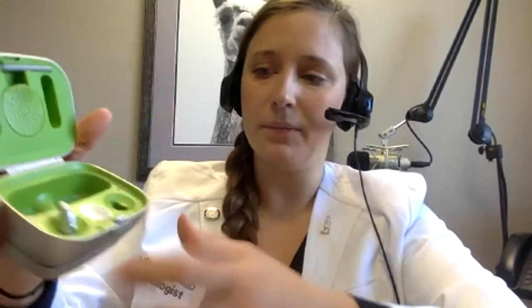Some hearing aid chargers have a drying unit built into them, like this one here. There are little desiccant beads that go in there. Go ahead and put your hearing device in there right away to try to pull out that moisture before it gets stuck in there. So I think my dad will be okay. However, he might have to repair it sooner than if he would have followed those other steps. That moisture might percolate in there and have an effect later on.